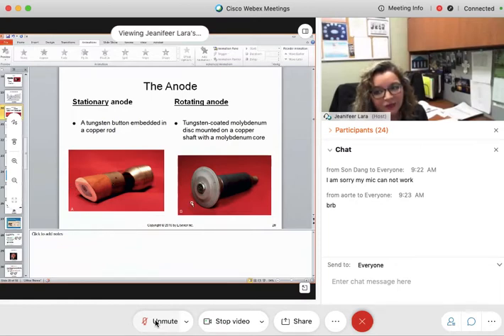Here, electrons are going to hit at the actual focal spot, but it is along the entire track because the track continues to spin. I hope that is making sense. If you take your umbrella and you point, you'll understand why it's important to have a focal track made of tungsten plus rhenium, because you're going to have interactions happen along it. I'll continue to explain it a little bit more.